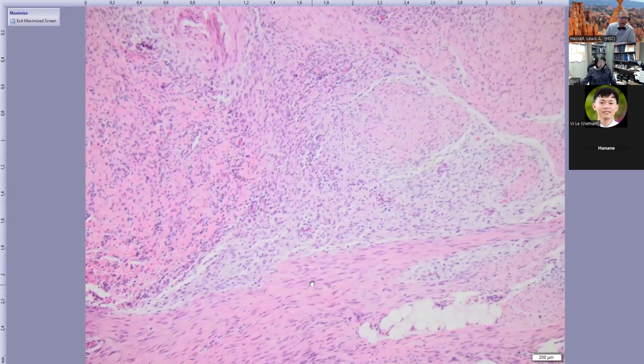Zhongxin, is this related to fibromatosis that we see in adults? No, it's different. Beta catenin is usually negative. Usually not very aggressive. But you know, it's an infant. The family may be really worried, having a tumor. So they want to know the rapid diagnosis. So when we get this, we can make a diagnosis. Usually when we see the tissue, we can make a diagnosis immediately, and that usually helps.